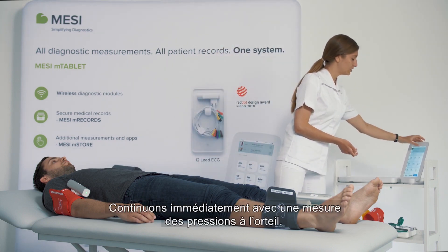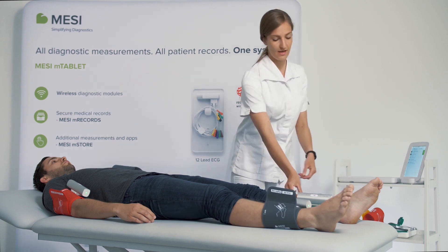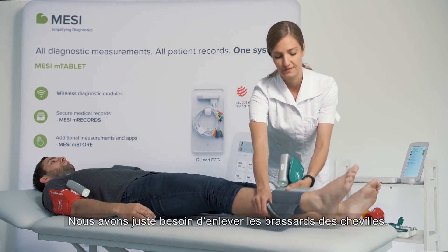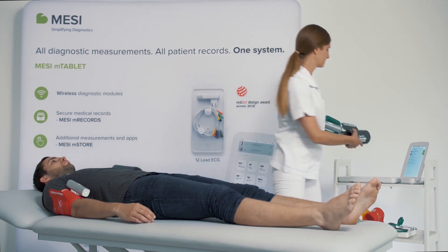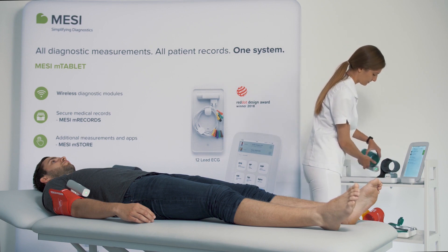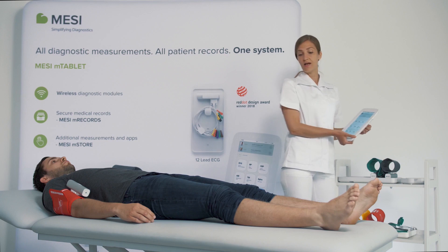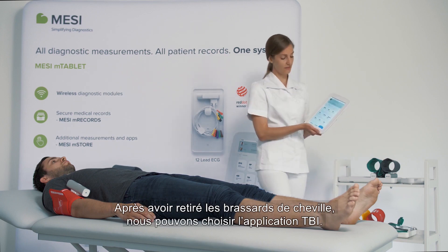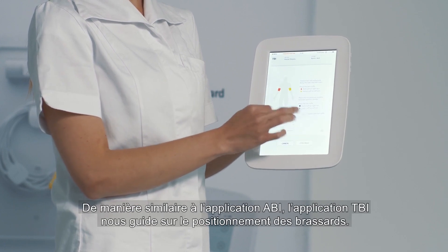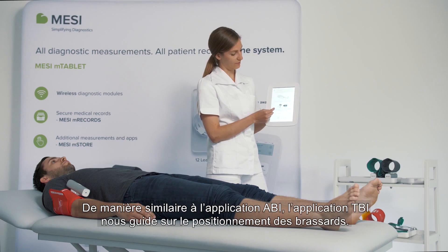We can continue to the toe brachial index measurement immediately. We will just need to remove the ankle cuffs. After removing them, we choose the TBI application, which, very similar to the ABI application, guides you through the correct cuff placement.